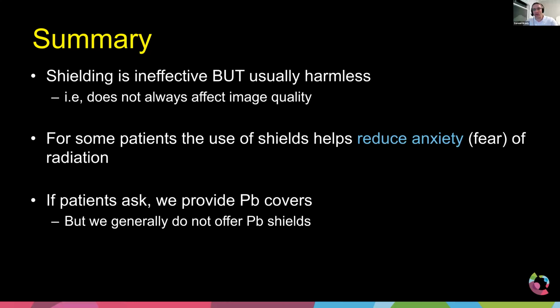So when we image a pregnant woman, we talked about this actually a couple of weeks ago, there are techniques we can use to lower the mA, to lower the exposure. We can use organ dose modulation techniques if we have to, which reduces the dose anterior, so that's obviously where the baby is. So there are ways for us to reduce the potential for risk. And that can be said about an x-ray, a digital radiograph.